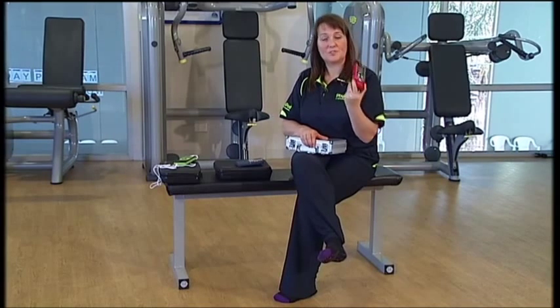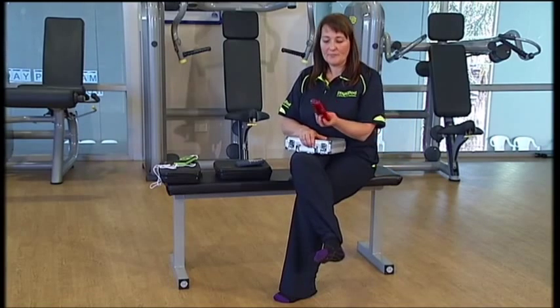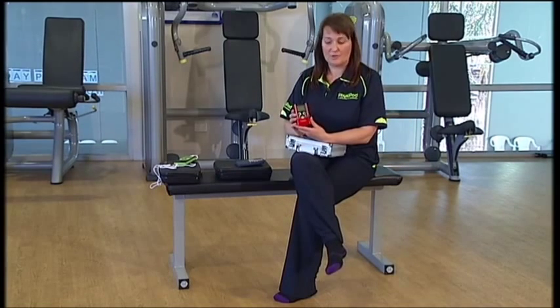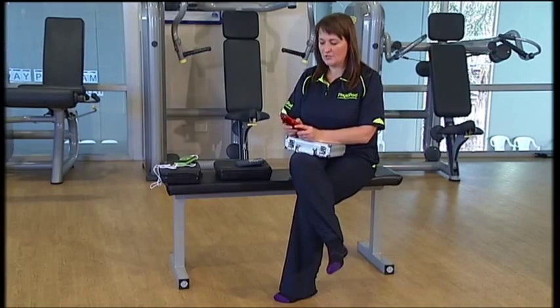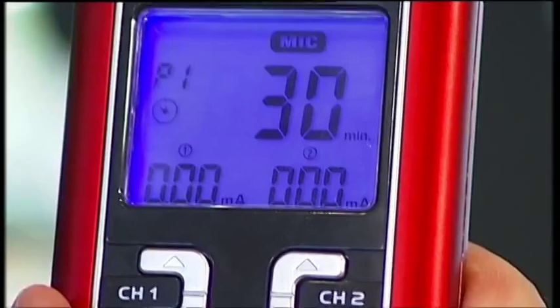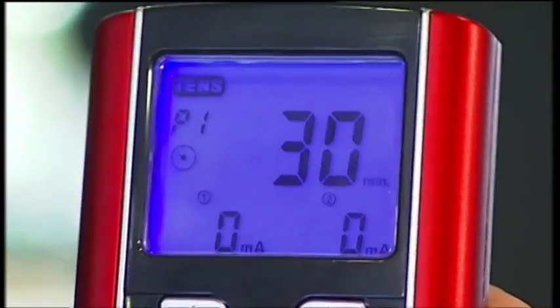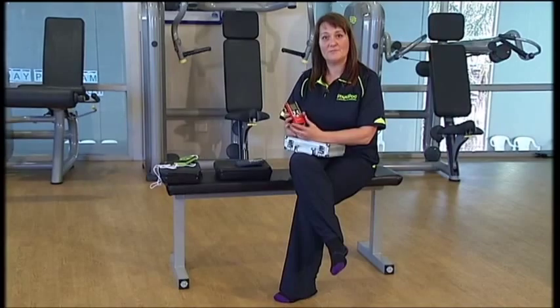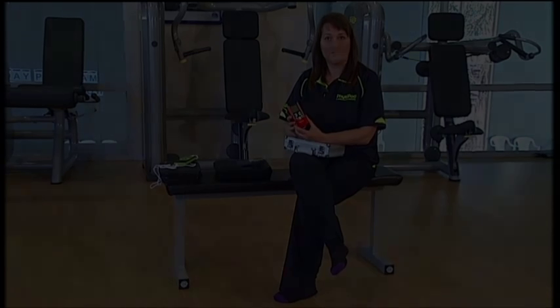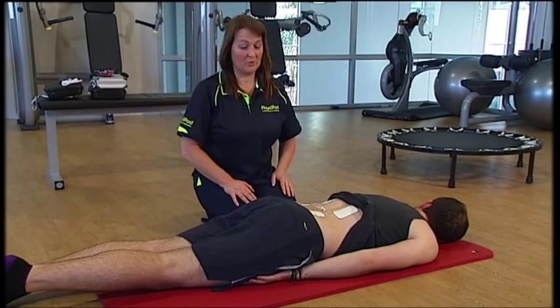It comes with a belt clip so you just clip that onto your trousers or your shirt and away you go with your treatment. It's quite easy to use with a backlit LED function, and you choose the modalities — TENS, EMS, microcurrent, or interferential — according to the condition that you're having treated. We're now going to run through some of the more common injuries that might be treated with TENS, EMS, interferential, and microcurrent.